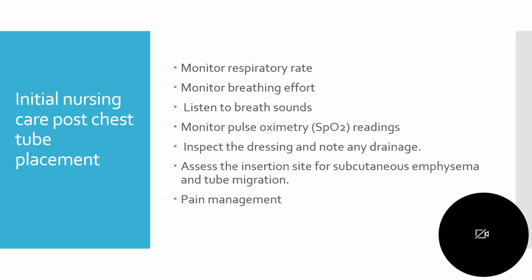And sometimes you may have to change the dressing, and when you do that, you want to assess that insertion site for what we call subcutaneous emphysema. That is sometimes air or fluid underneath the subcutaneous tissue, which is going to tell you that the chest tube has come out of the lungs and is in the surface tissue. And these feel like Rice Krispies. And then another important aspect of this initial care is pain management.